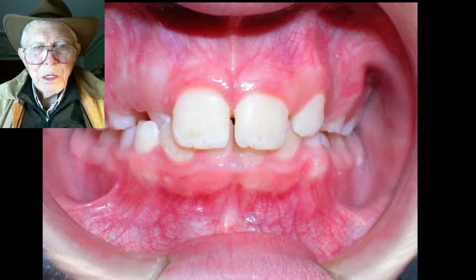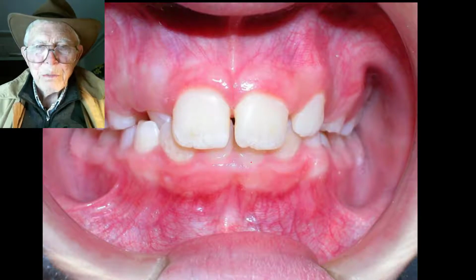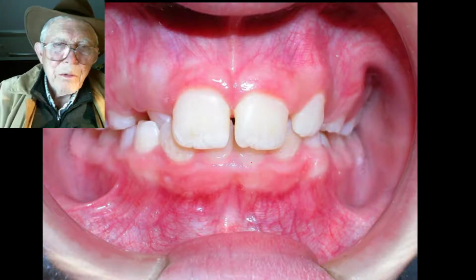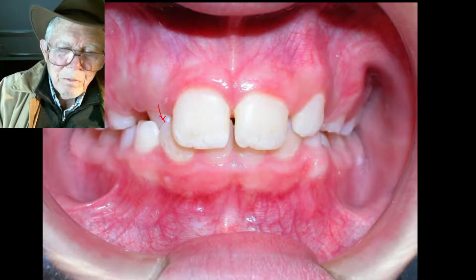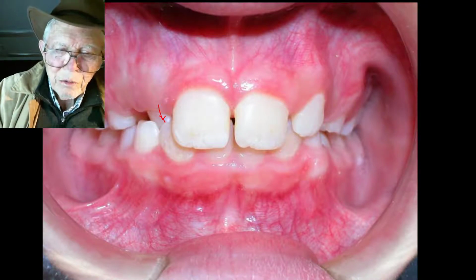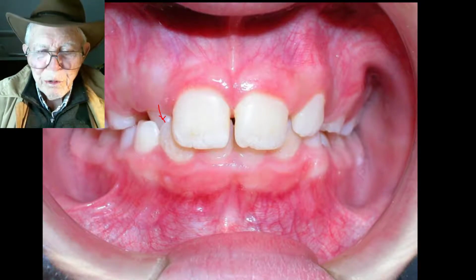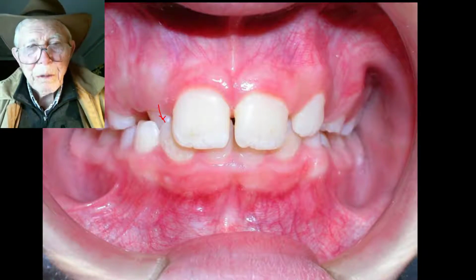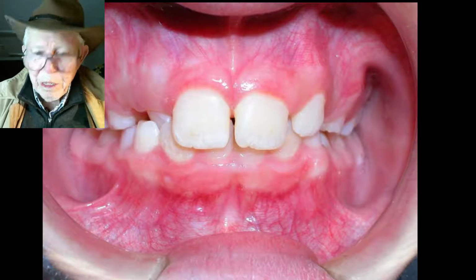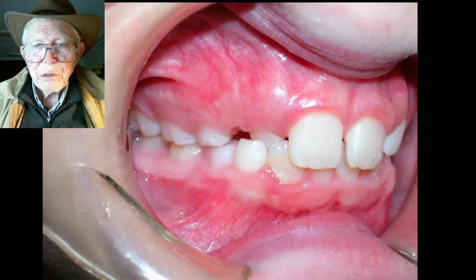The upper arch is overlapping the lower arch, except with one spot right up here around this lateral, which isn't a very difficult thing to deal with, pretty easy. So we'll correct that lateral and get it out into space, the proper space for itself. Now let's go ahead and look at the other views.